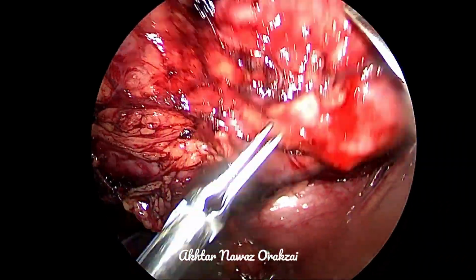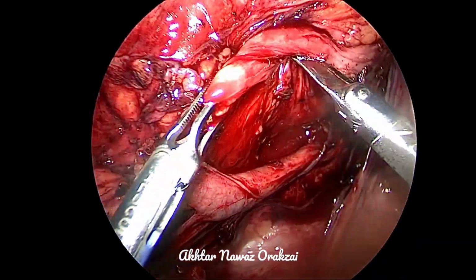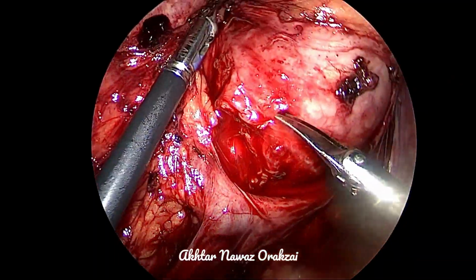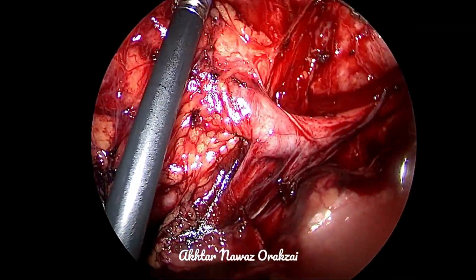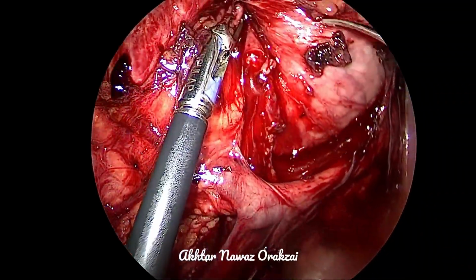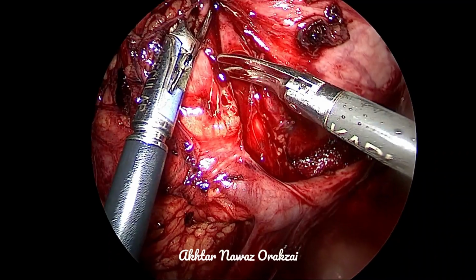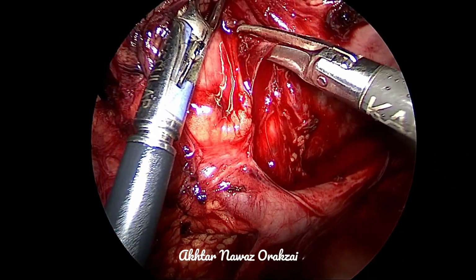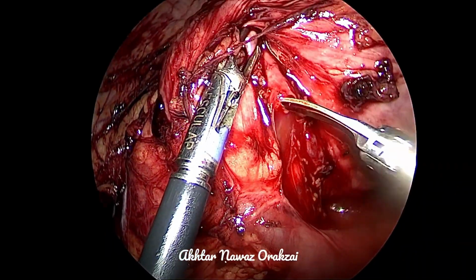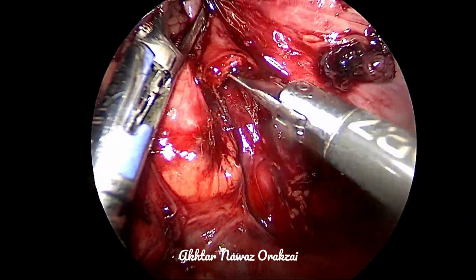Another satisfying thing for me in diagnosis is that after cutting the ureter at the PUJ, there is no urine coming from the pelvis. And this confirms that there is an intrinsic factor to the PUJ as well, apart from the extrinsic factor.